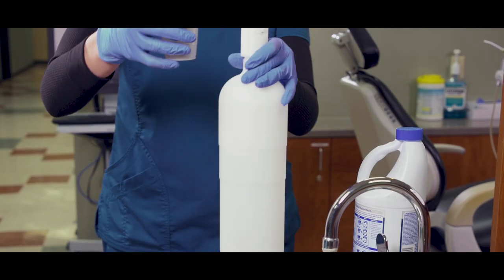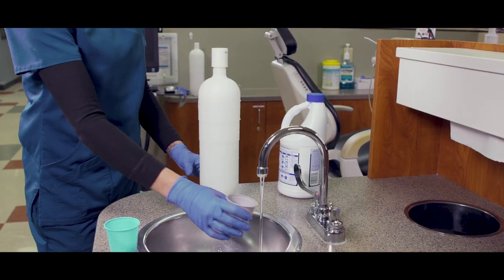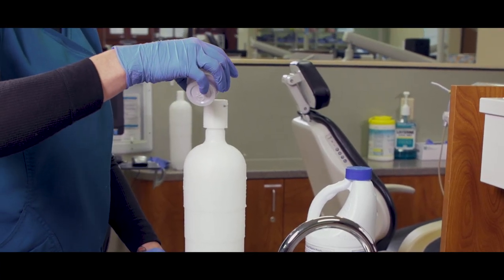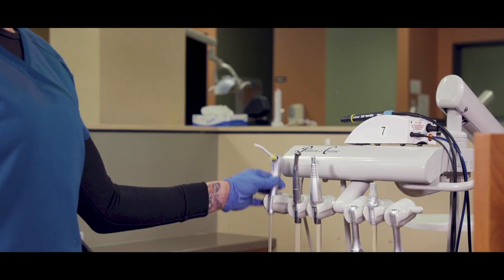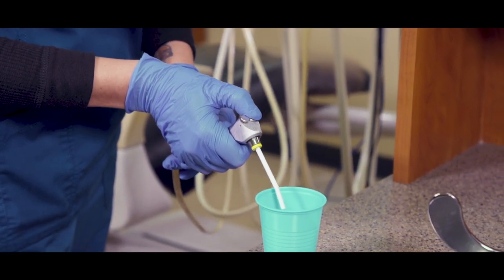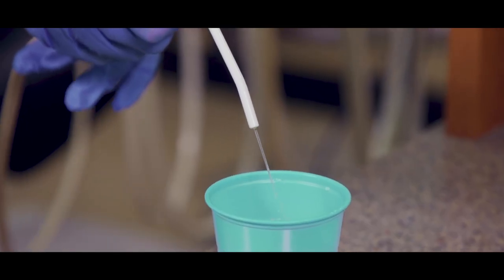Pour the bleach into your measuring cup and then into your unit's water bottle. Do the same with the water, making sure to meet the correct ratio of bleach and water. Now that we have our bleach solution, reattach the bottle to the unit and start running the solution into each line. We'll start with the air water syringe — place the tip into your sink, collection cup, or bucket, and activate the syringe.